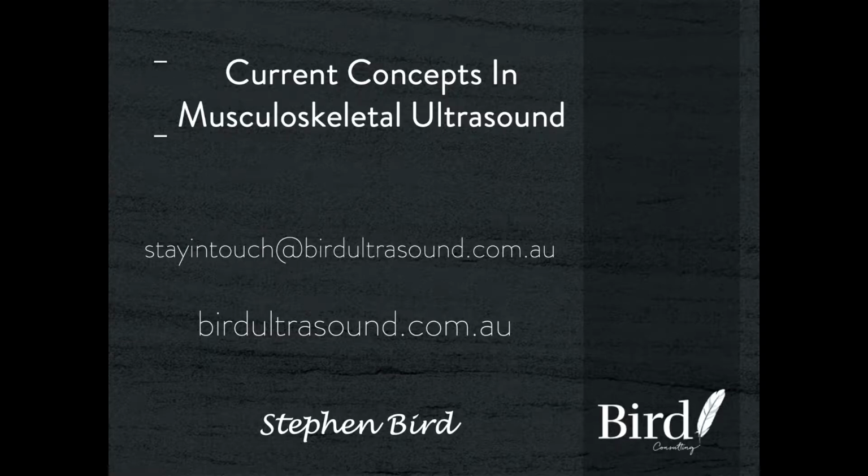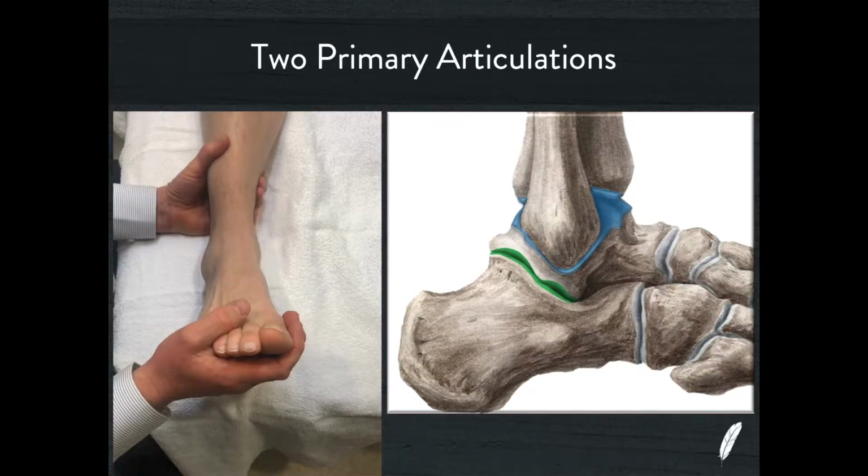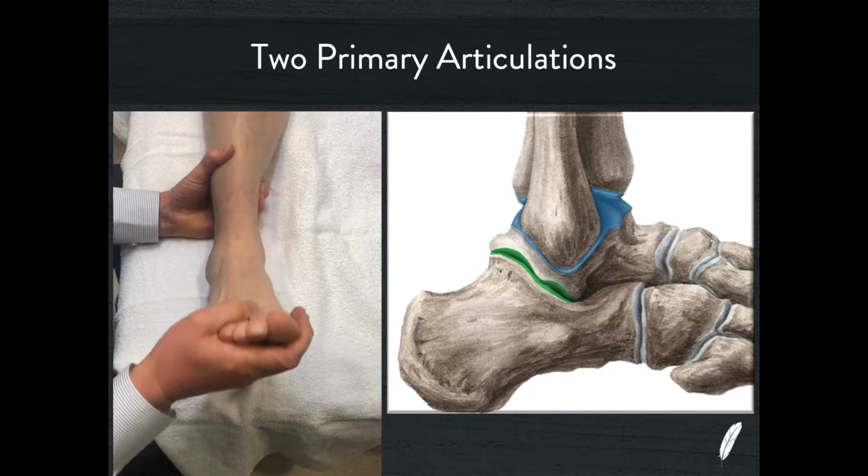In this presentation, I'm going to delve into some fresh ideas and concepts that have changed the way I perform my musculoskeletal ultrasound in a variety of body areas. The first area I'm going to consider is the foot and ankle.